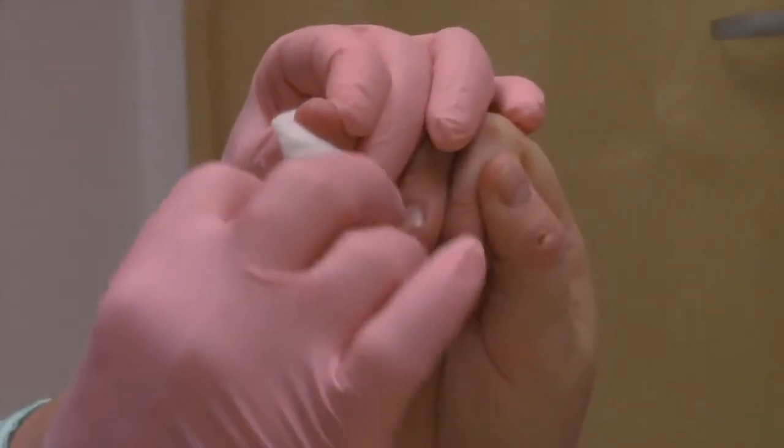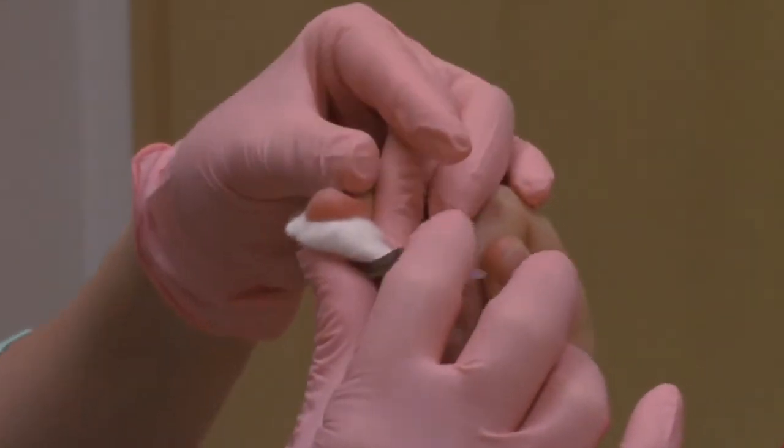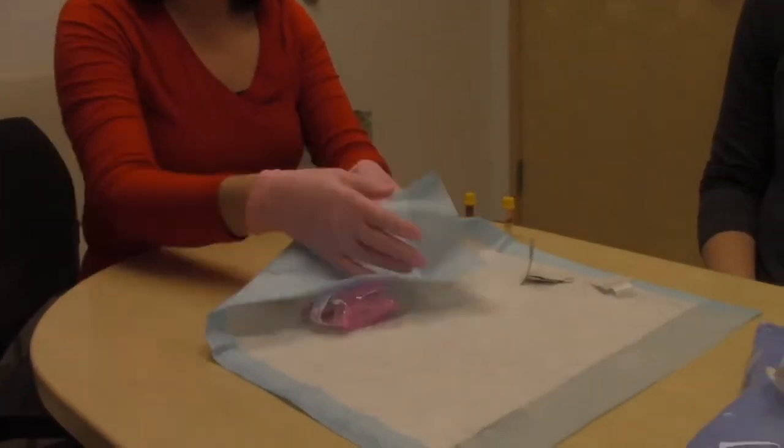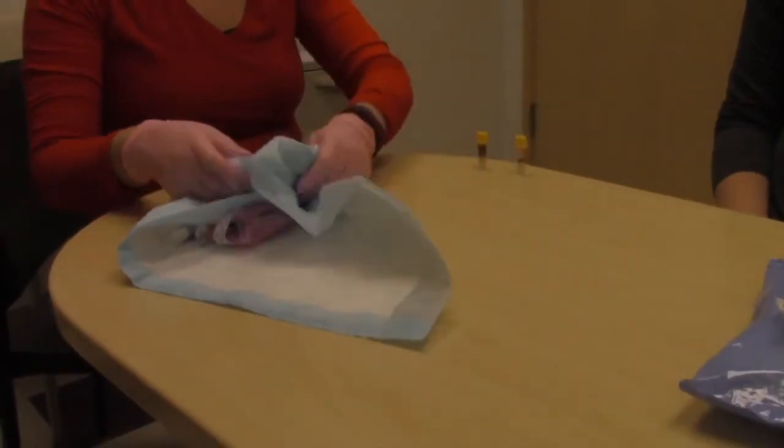When you are done collecting the sample clean the fingertip then place the cotton ball and band-aid on the finger. You can throw all of the supplies from the finger poke in the regular trash.